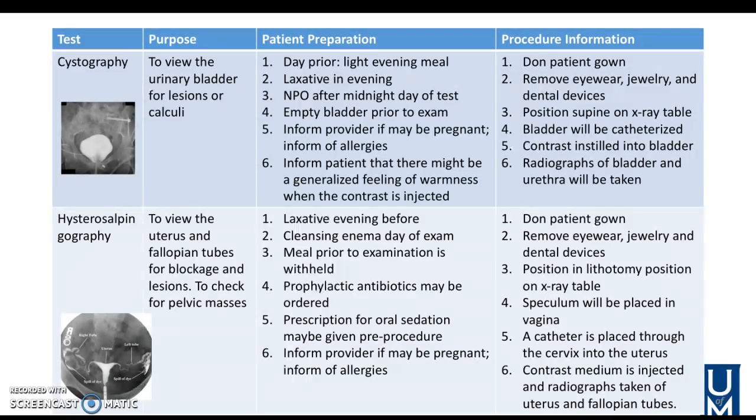The next one, hysterosalpinography. I know that's a long word, but this test is used to view the uterus and fallopian tubes for any blockage and lesions. This is also used to check for pelvic masses.